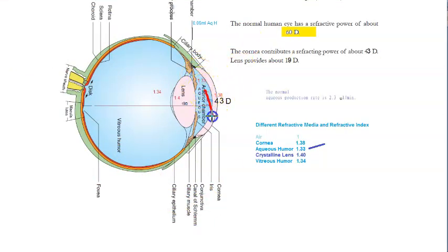So what are they trying to measure? They are measuring the intraocular pressure. So what is intraocular pressure? It is the fluid pressure inside the eye. So you have this aqueous humor here, right? In your posterior chamber and your anterior chamber, that is posterior is behind your iris. Here and here, you have this aqueous humor. So basically, the intraocular pressure is the measure of this fluid pressure.